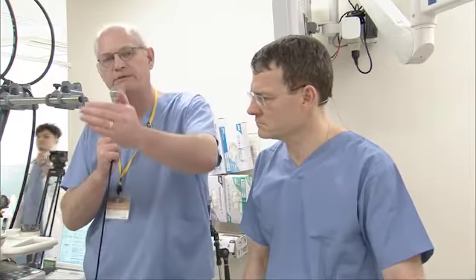In this case, you may not be able to get to the more upstream duct because of the blockage from this lesion. So I'm not sure that pancreatoscopy would help unless our tissue was suboptimal, and then maybe you could do some intraductal biopsies.